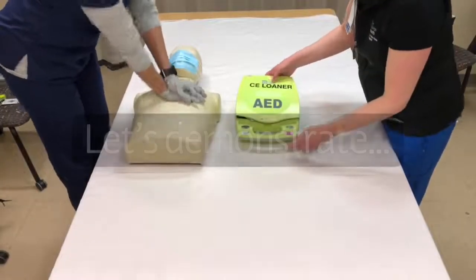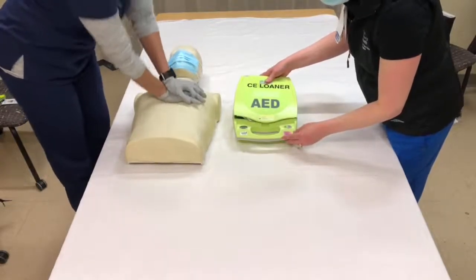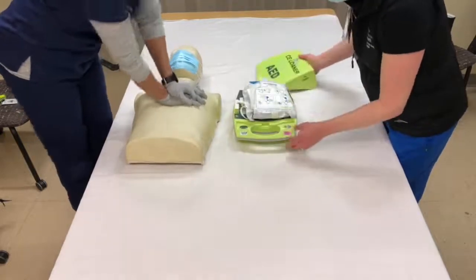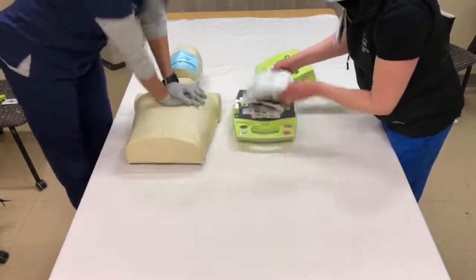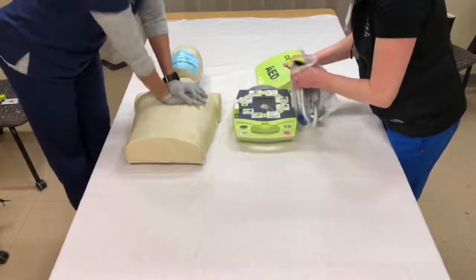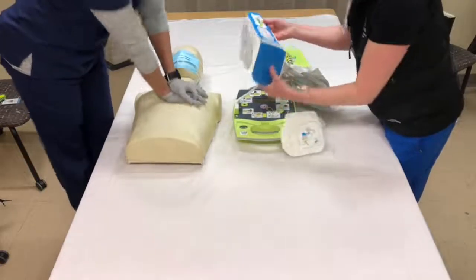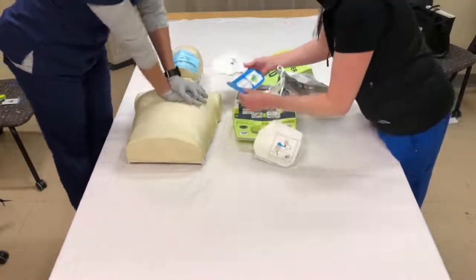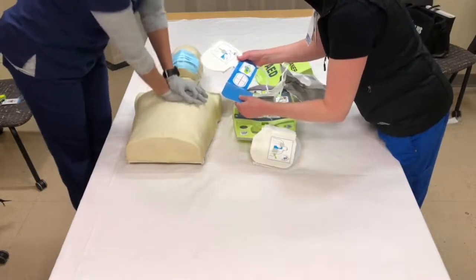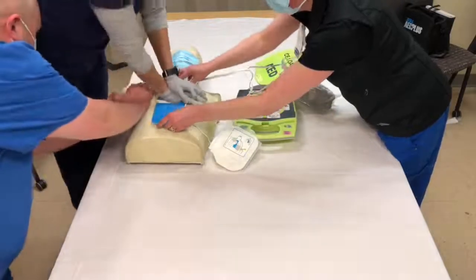In a cardiac arrest, our goal is to get the AED on in less than 2 minutes and analyze the rhythm. I'm turning on the AED. I'm applying to the patient with a minimum of interruptions in CPR. Check responsiveness. Call for help. On my count, interrupt CPR so I can place the pads. Attach pads to the patient's bare chest. 1, 2, 3, stop CPR. Resume CPR.